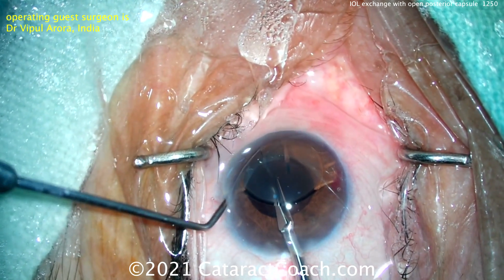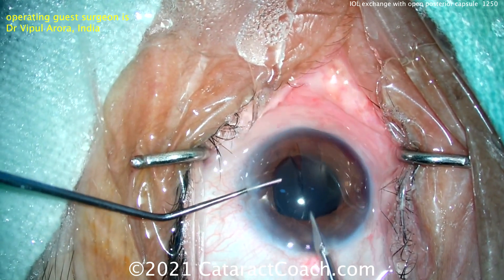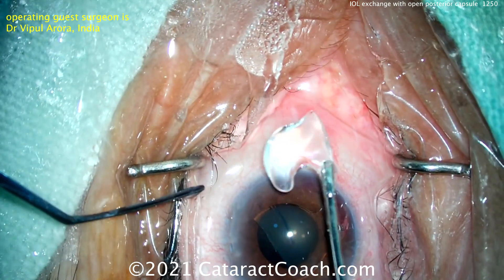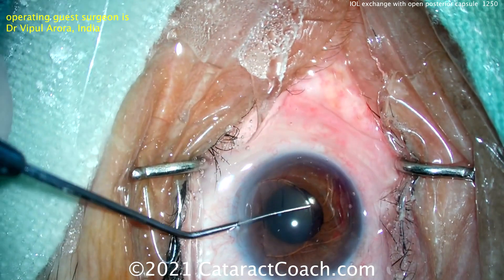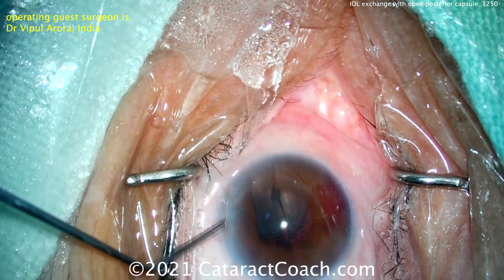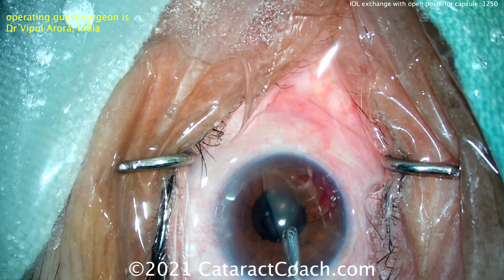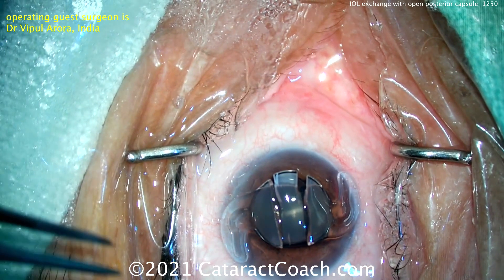Nice and easy — fixating and holding the IOL with the chopper or hook, then cutting it all the way through. These pieces can be removed from the eye quite easily. There's one piece. I like the idea of putting the IOL back together and reassembling it outside the eye to make sure you haven't left any small slivers inside. Make sure there are no missing pieces — if there are missing pieces, that could be a bad thing in the future, floating around inside the eye. Good, it's all complete.